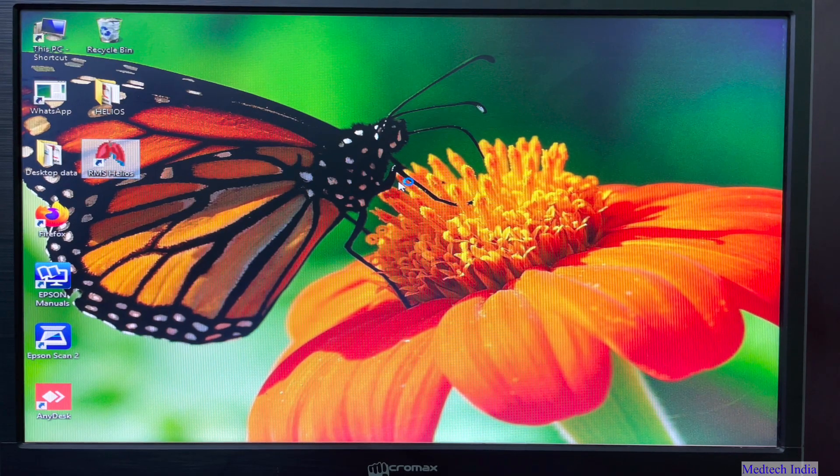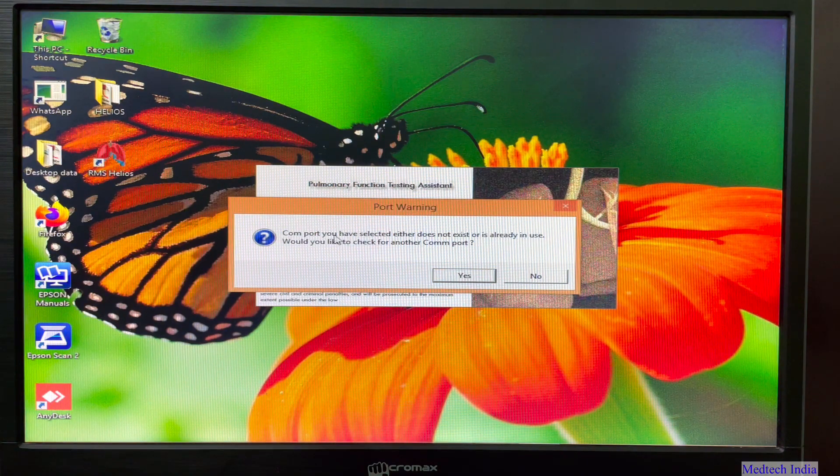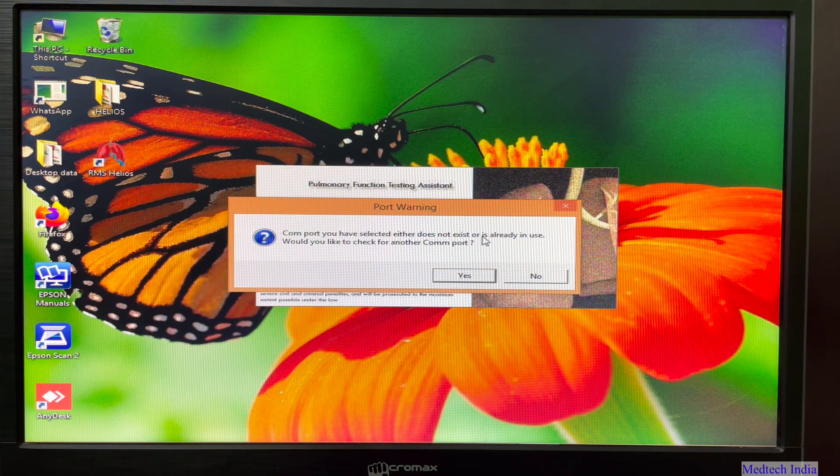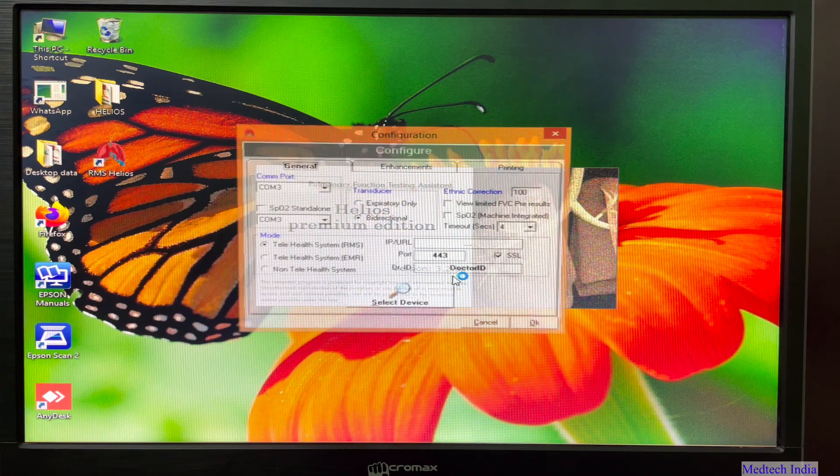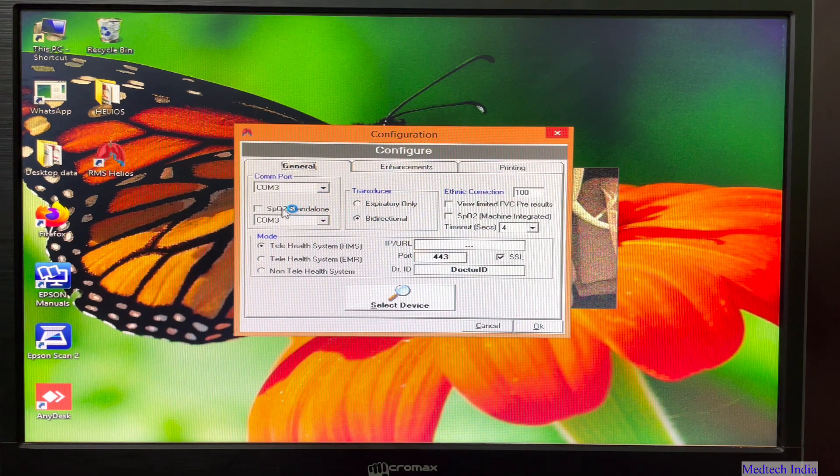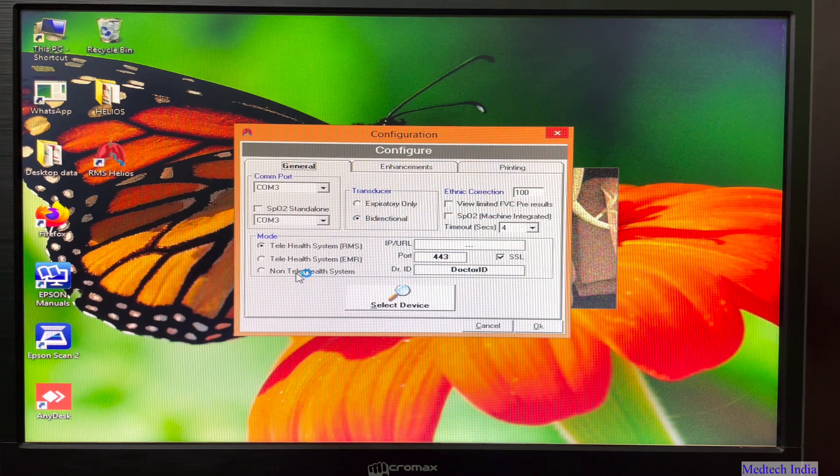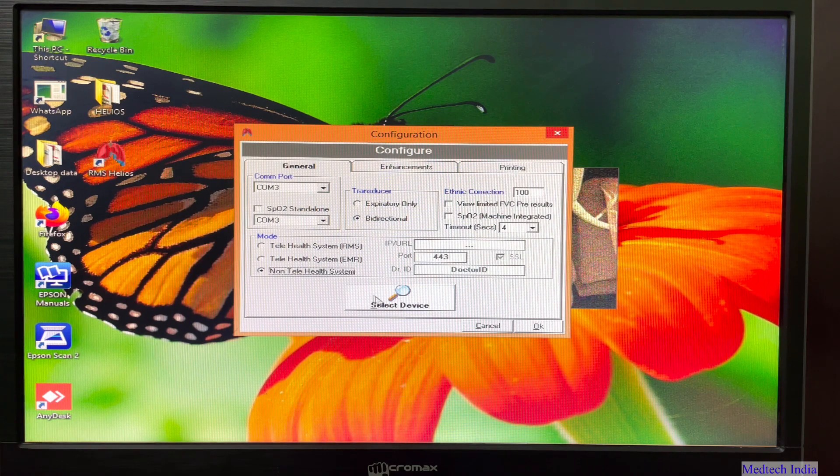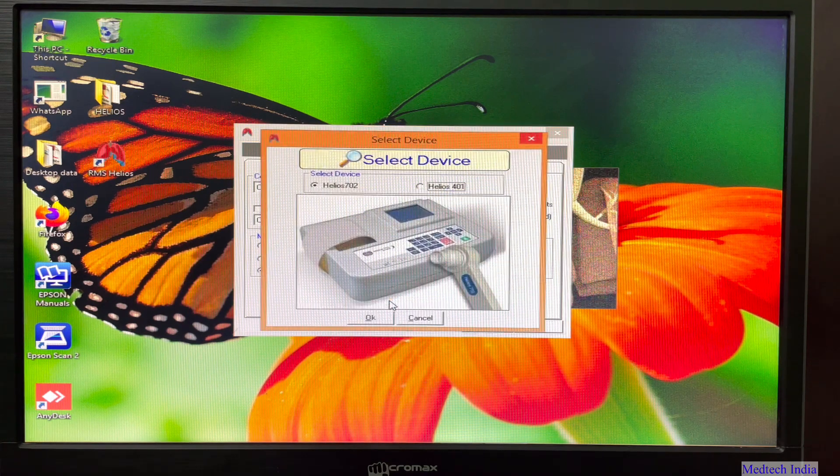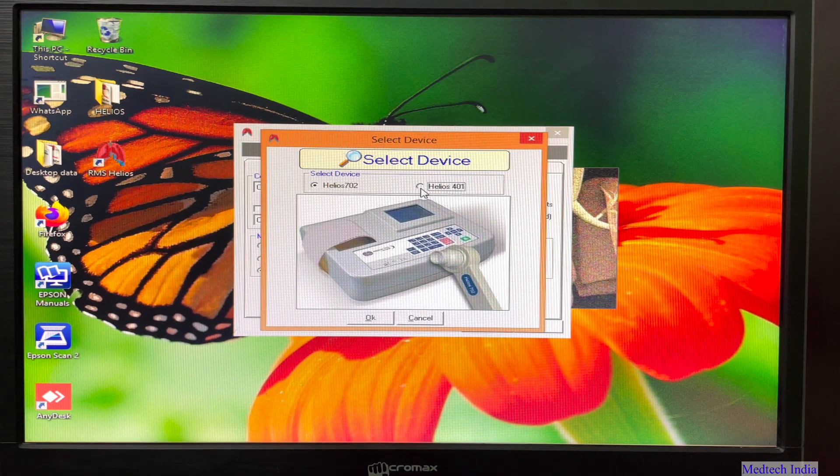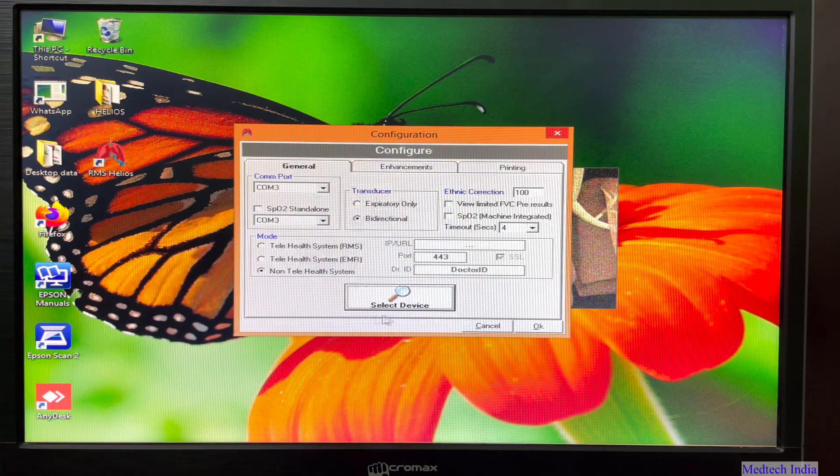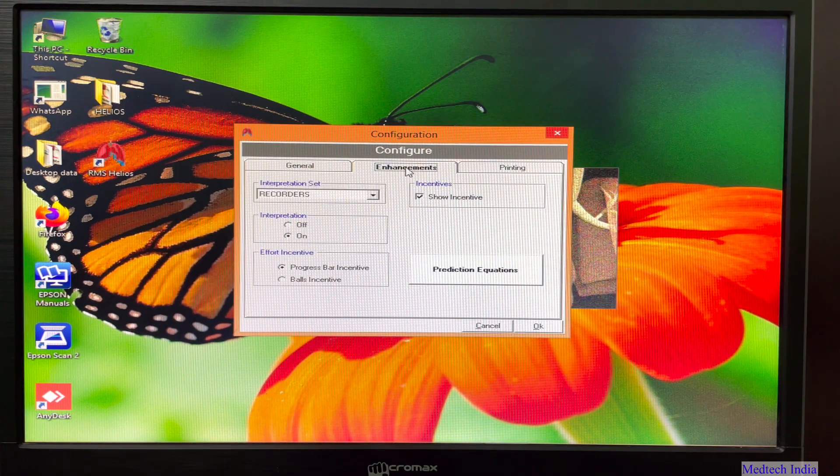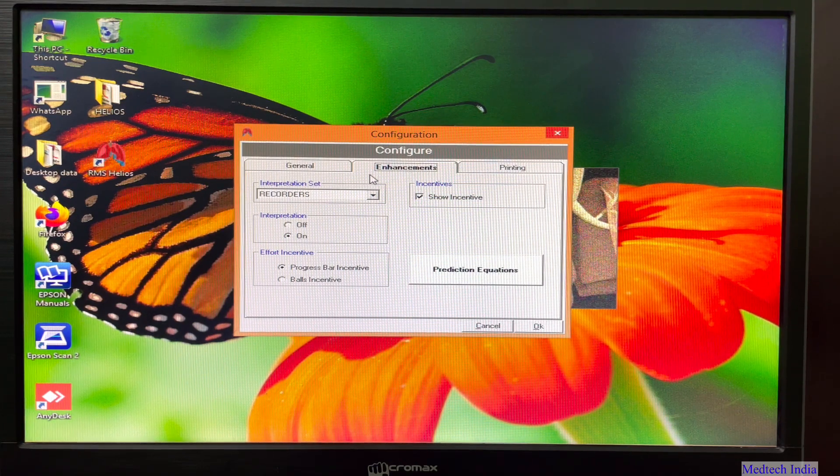You will need to double click on RMS Helios icon for opening the software. So after that, we will get this message: would you like to check for another COM port. Just click on yes. Then we will select here COM 3 port as we have seen earlier. Then mode, we need to select non telehealth system. Select device, we are using Helios 401. So we will select Helios 401 only. Then OK. Then enhancements. Here no changes required.